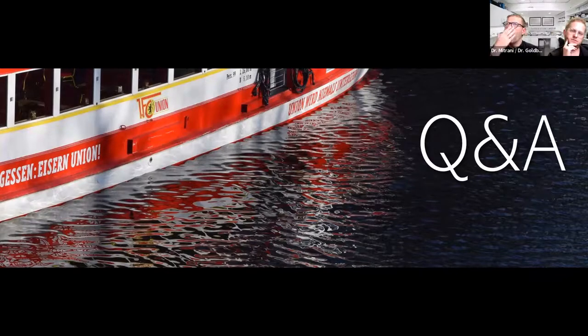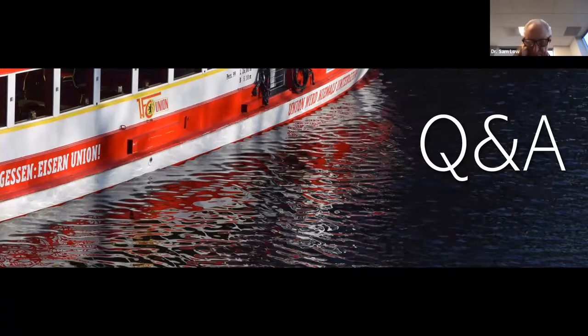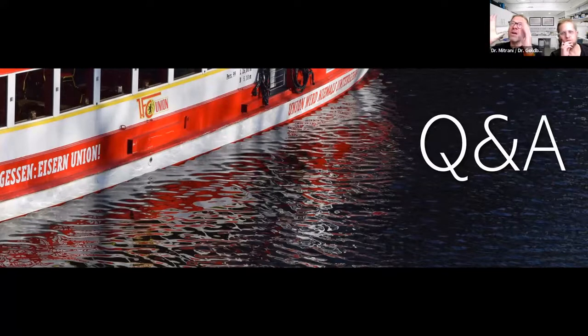And typically, where you don't want to miss that biologic width, where typically we don't do a good job, is to remember that the gingival scallop is going to follow the bony scallop. Now, when you're doing a gingivectomy, what you want to make sure is that you see that phenotype. You see that's your bone both buccolingually, but also mesiodistally and apicocoronally. So you want to make sure that you go from line angle to line angle, in which you're able to smoothen where that bone is. I don't know if this makes sense, Sam.